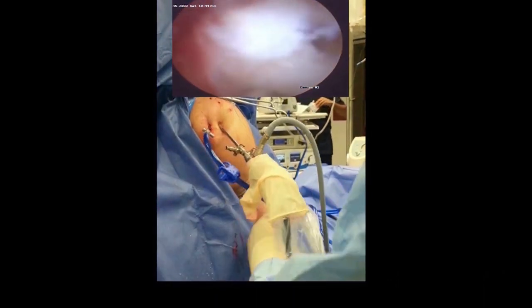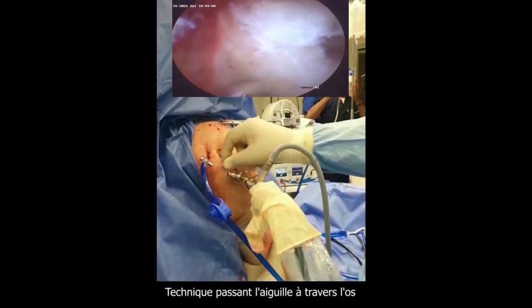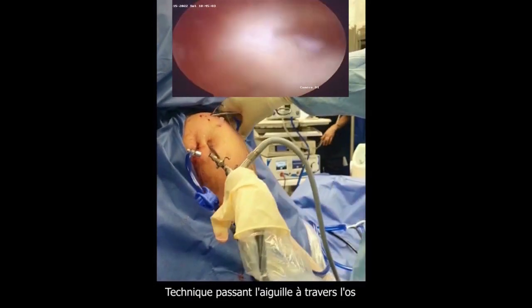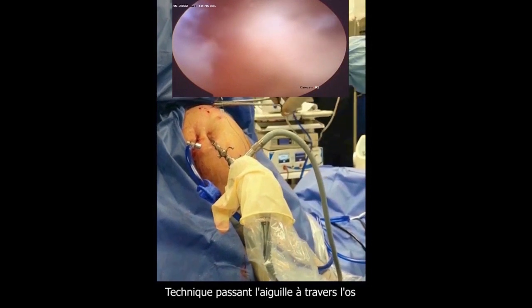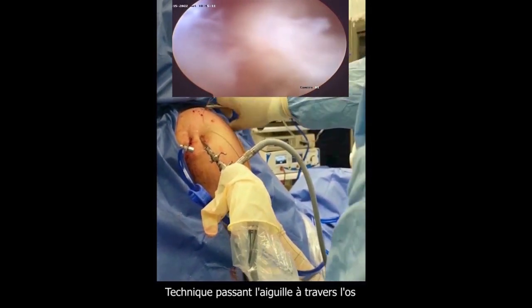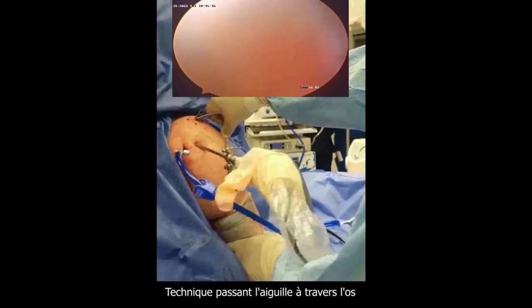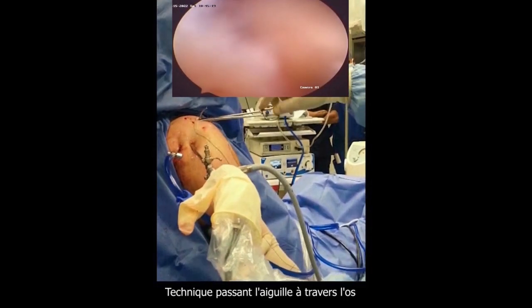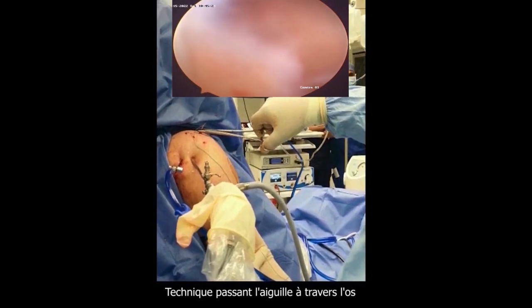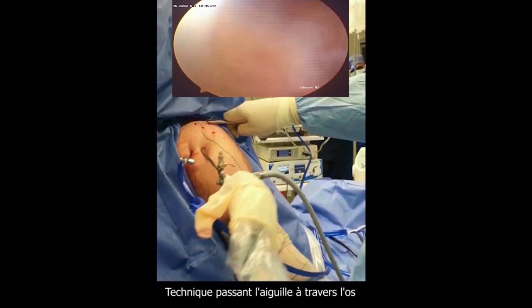The arm is held with the left hand from the elbow, and the needle is pushed in the bone by rocking the arm in internal and external rotation. It is pushed straight down in 90 degrees angle to the head in a stepwise manner, centimeter wise, till it comes out through the skin laterally.